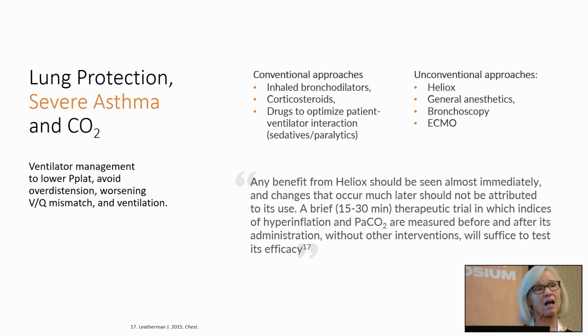Sometimes we'll use Heliox, which is a lighter gas, and so the patients can move it in and out of their lungs better. But Heliox is one of those things where if it's going to work, you're going to know within 15 or 20 minutes. So you want to try it for 15 or 20 minutes to see if that helps the patient's work of breathing, if it helps their oxygenation status, and if you can see their CO2 status to see if it helps their ventilation status.